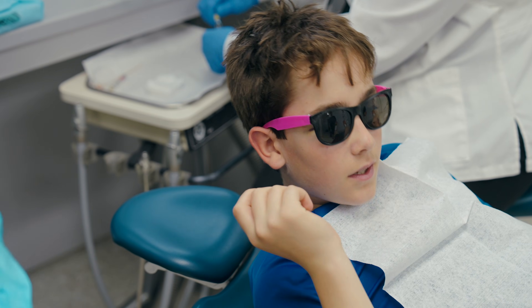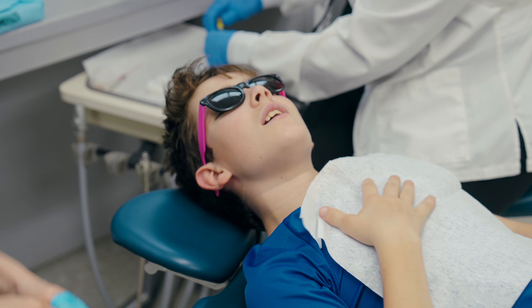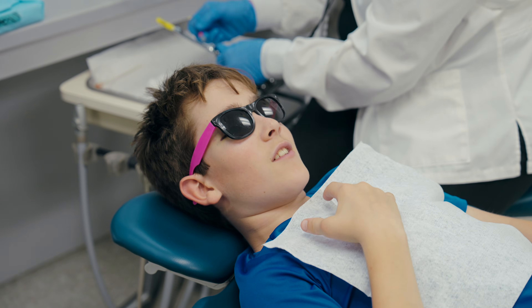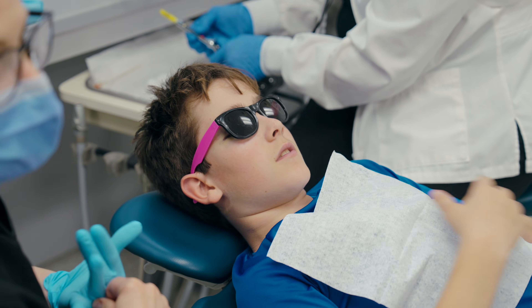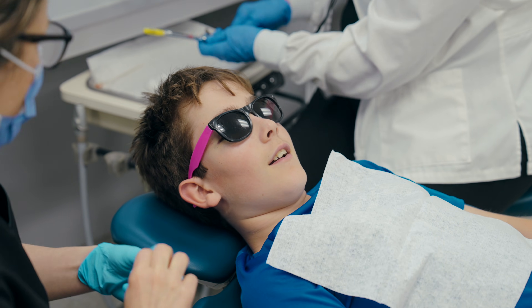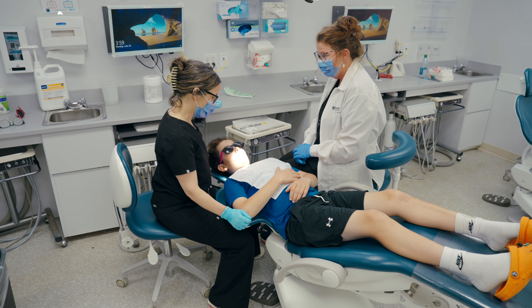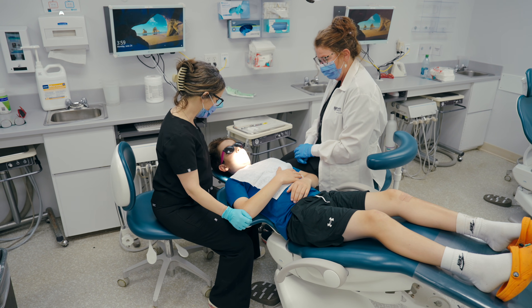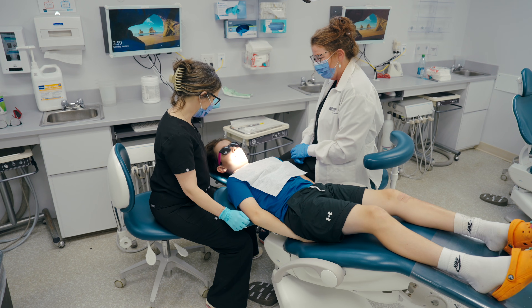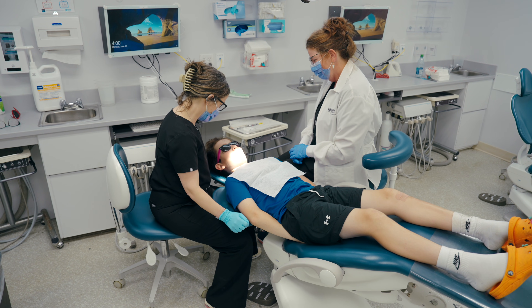Patients should be fully reclined in a supine position with the head comfortably in the headrest. Patients must be wearing eye protection at all times. During local anesthesia administration to any child or adolescent, a dental assistant should always be chair-side to provide support to the provider. The patient is instructed to place their hands under their bottom.